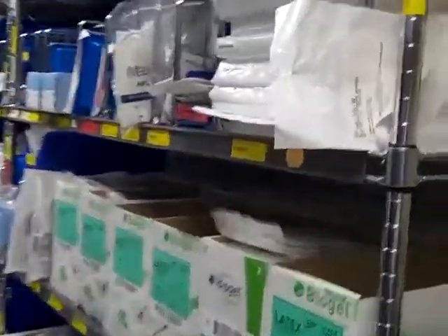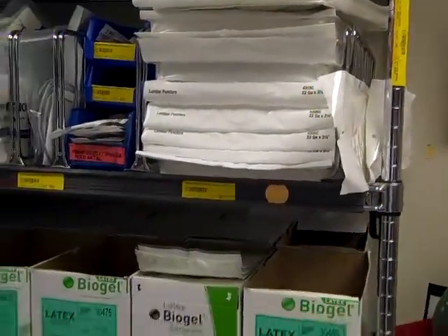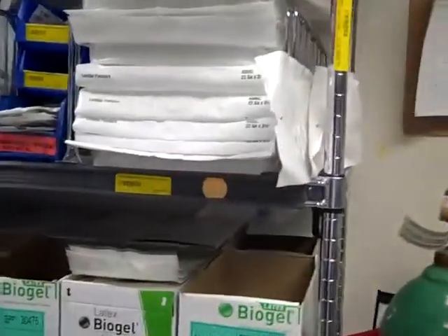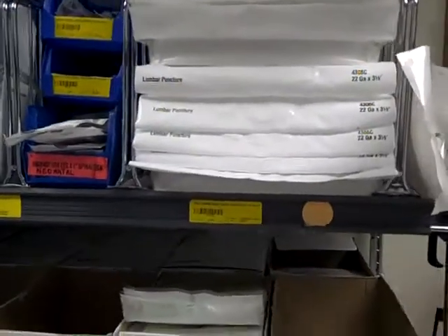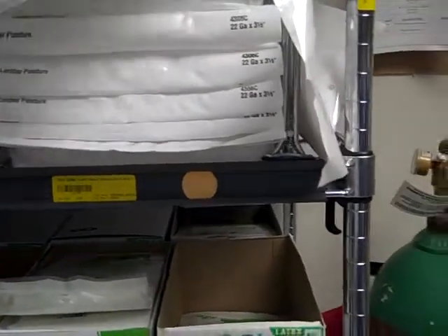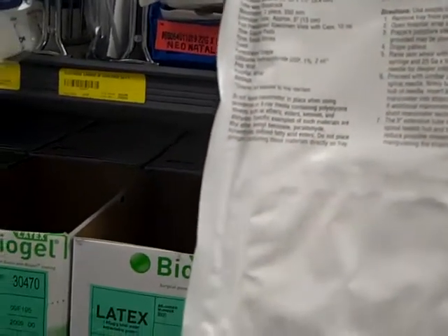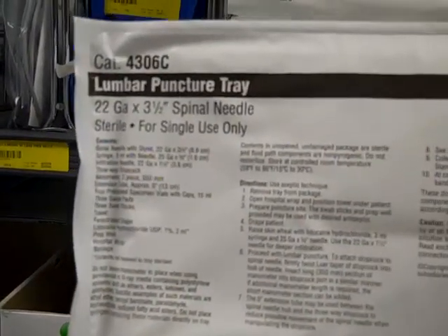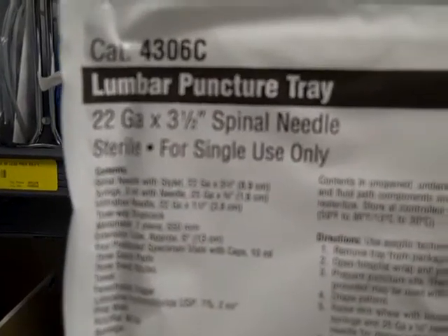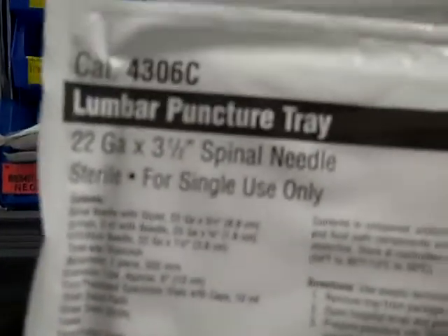You're going to need the LP kit. The LP kits are located right here on the right wall, right above the gloves. There are adult and pediatric LP kits — at this time it looks like there's only some adult ones. You can pull the kit here and usually tell right there — the 3.5 inch needle is the long needle, so that's obviously designed for an adult.